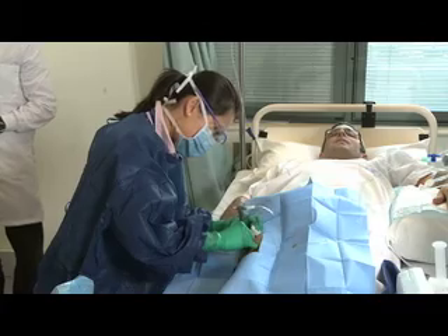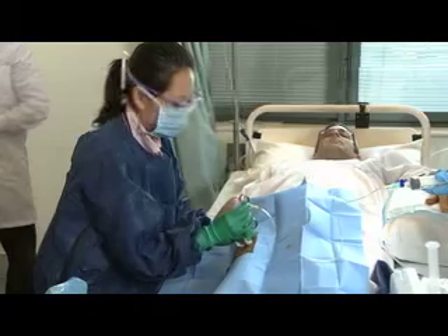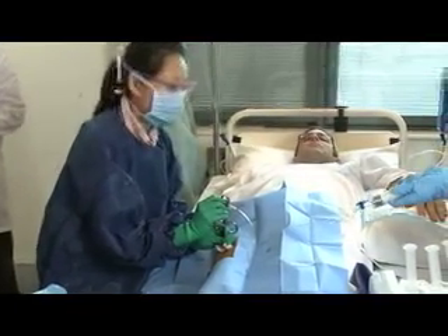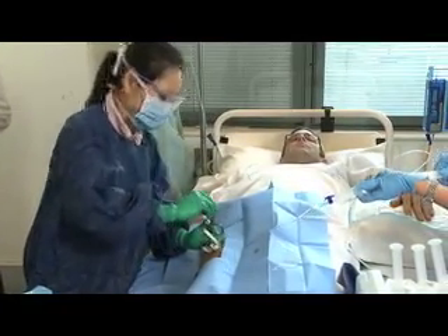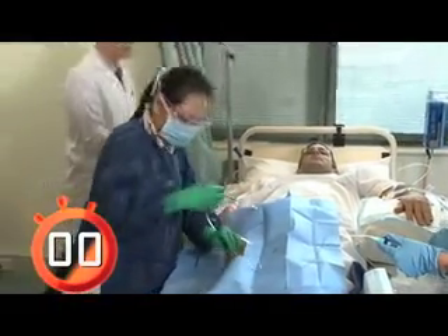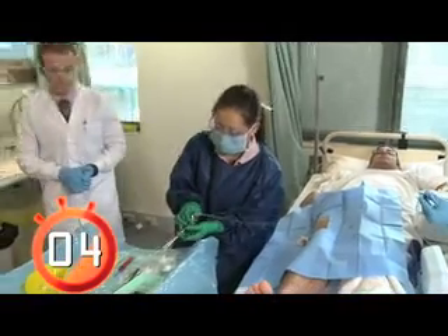Still okay? Yeah. Lovely. So I'm going to open the window — block off the whole suction please. Lovely. Push please, Ashley.